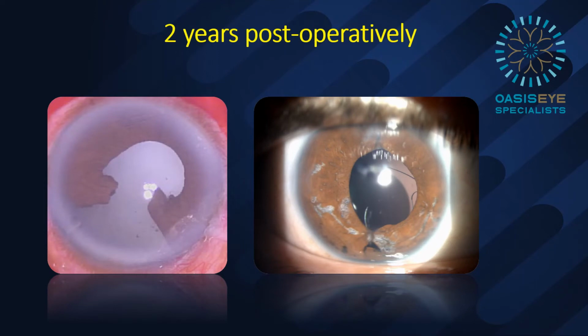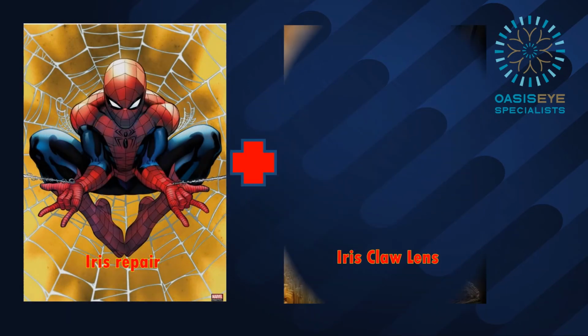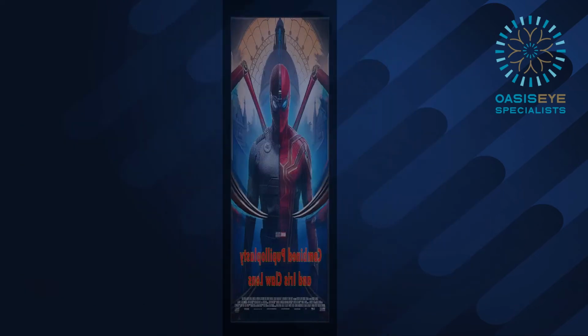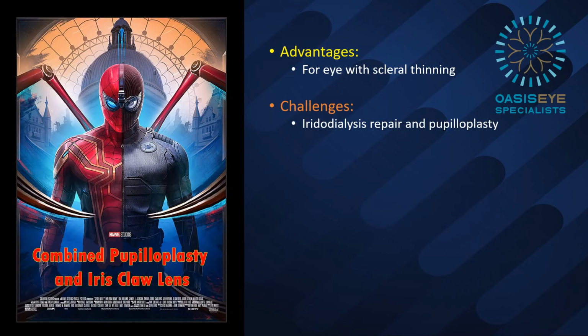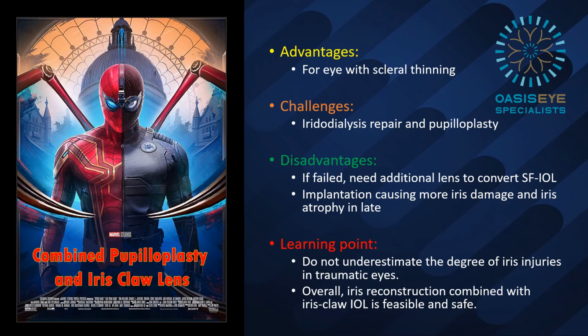Combined iris repair surgery and retropupillary iris claw lens show to be a safe surgical technique. Even after 2 years of follow-up, the lens is still stable and center located. Again, combined pupilloplasty and retropupillary iris claw lens is safe and feasible. In this case, we prefer to avoid sclera fixation in severe traumatic eye with sclera thinning.